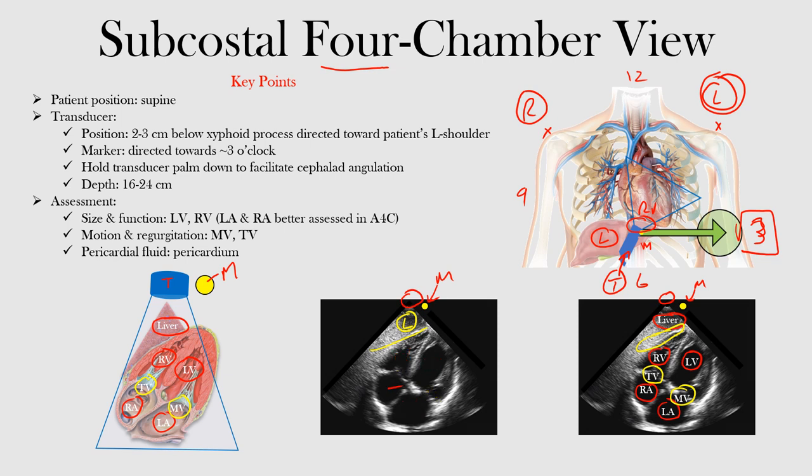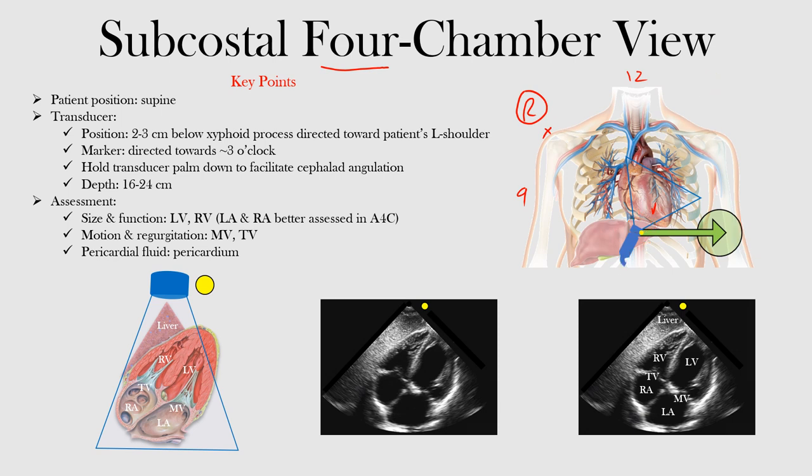Now I'll remove these labels so you can see the image clearly. Let's review what we discussed. In this position, we take that transducer, put it below the xiphoid process, direct it towards the patient's left shoulder, and have the marker towards three o'clock. We want to hold the transducer palm down to facilitate that cephalad angulation in order to see the chambers.